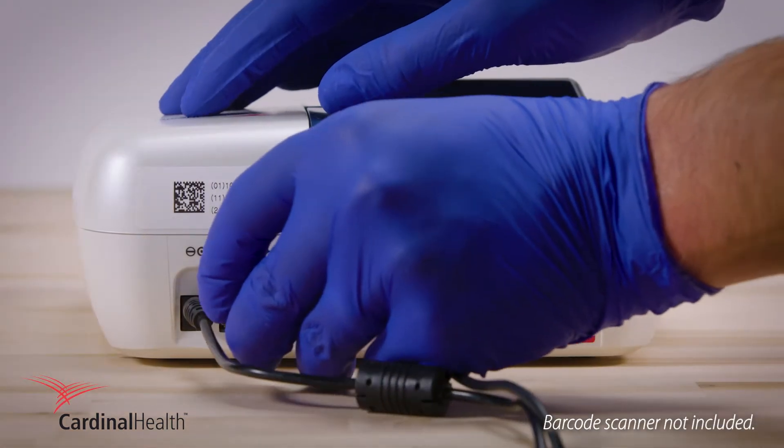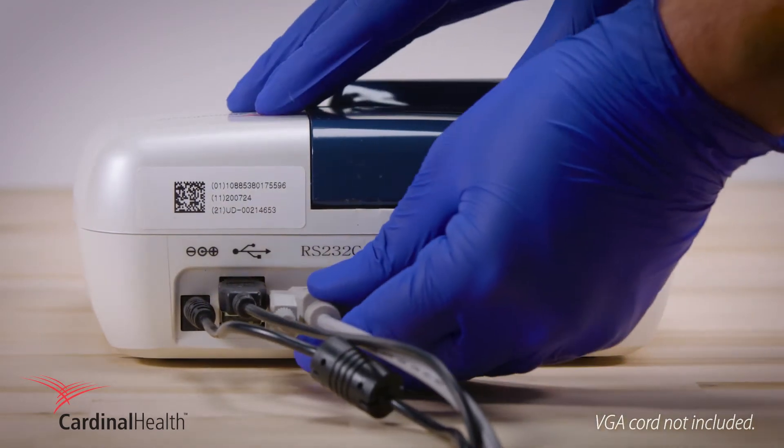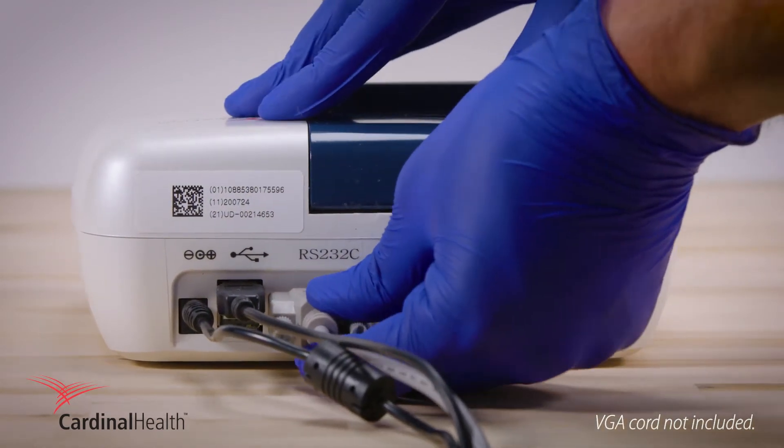Connect any barcode scanner through the USB port and use a standard VGA cord to connect to the host computer and LIS.